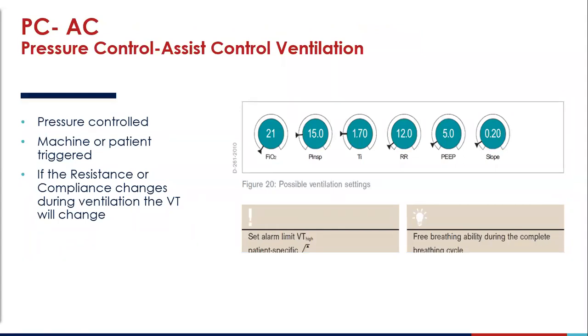PC-AC, also known as pressure-controlled assist control ventilation. Here we are pressure-controlled. This can be machine or patient-triggered. If the resistance or compliance changes during ventilation, the tidal volume will change.